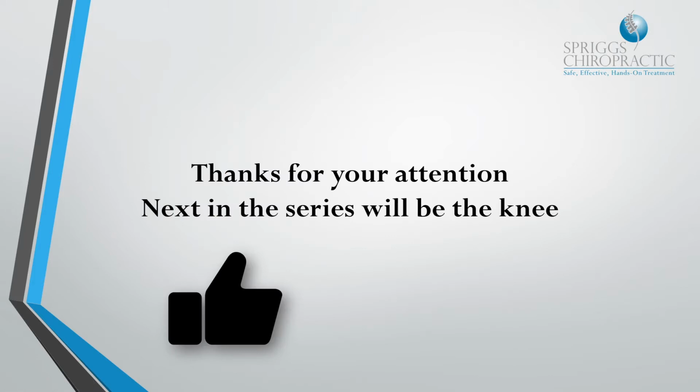So thank you very much for your attention today, guys. That is the main x-rays obtained for the foot and ankle evaluation. The next in our series will be the knee, so we're going to work our way up the body from now. We'll go lower limb up into the hip and pelvis, and then we'll work our way up the spine from there.